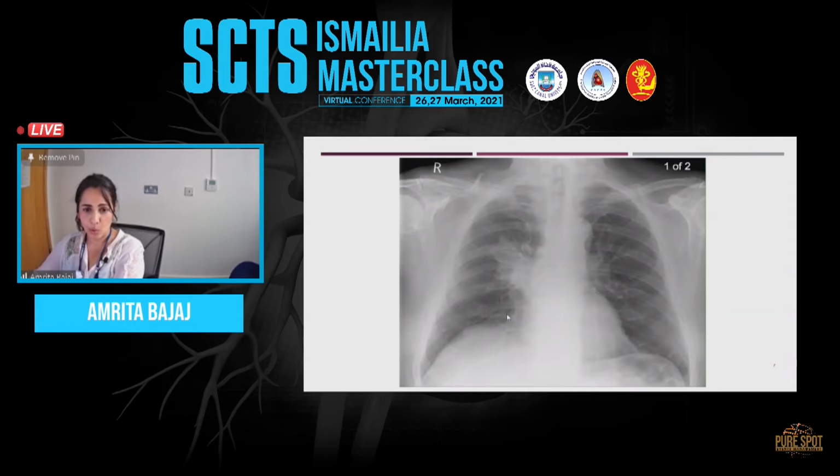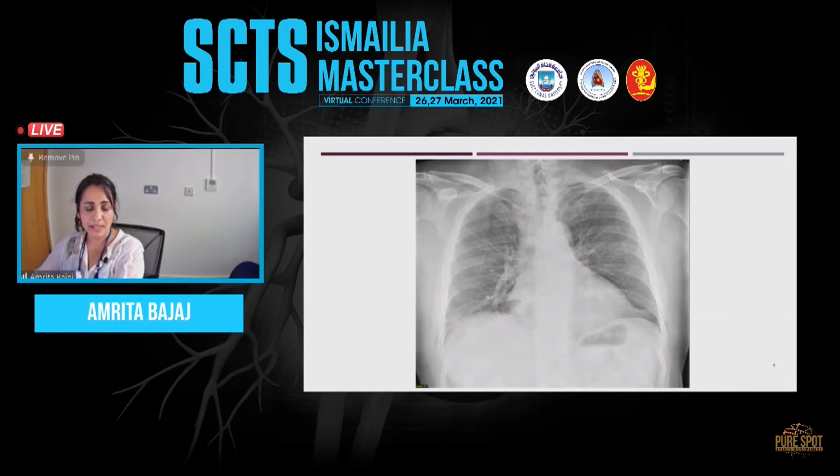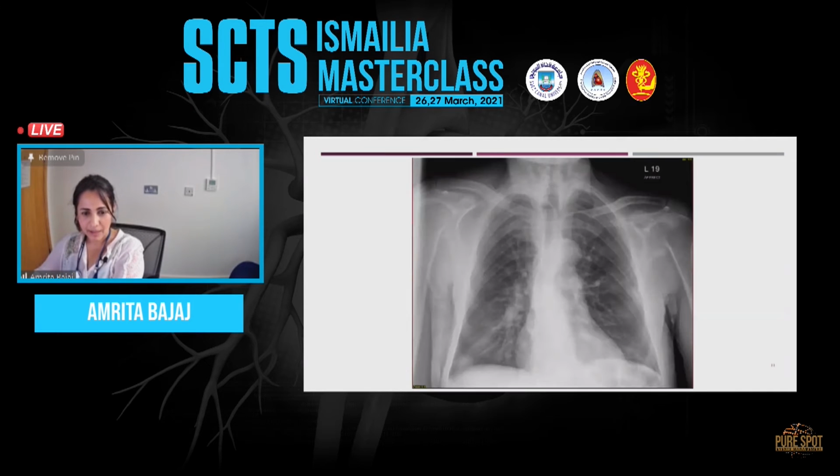And when it doesn't look normal is such as this, where it's a huge right hilar mass, or in another instance where the hawk-eyed ones may have picked up this non-specific right lower lobe nodule. I want to keep most of these images in sight, because as we keep going through the specialties, I will bring back these same cases again. Then another example where there is a more prominent nodule in the right lower lobe.